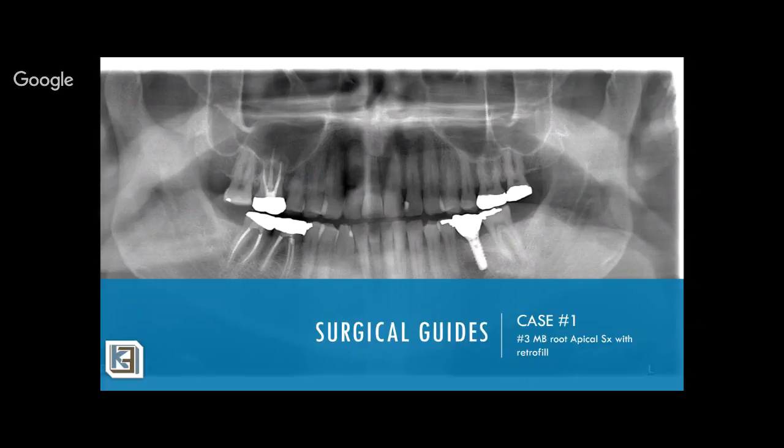Yeah. Okay. There's another question that came in. Is a metal sleeve needed for the use of the burrs? I noticed that the tube guide was becoming wider during the drilling, allowing the burr to wobble a bit.